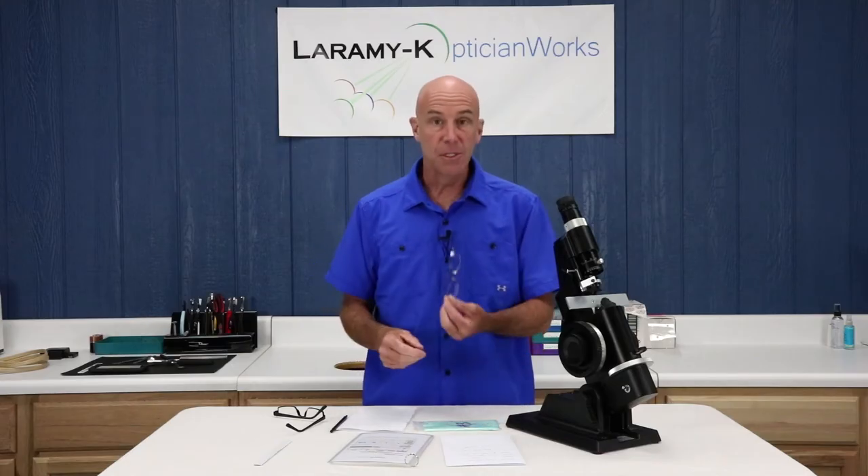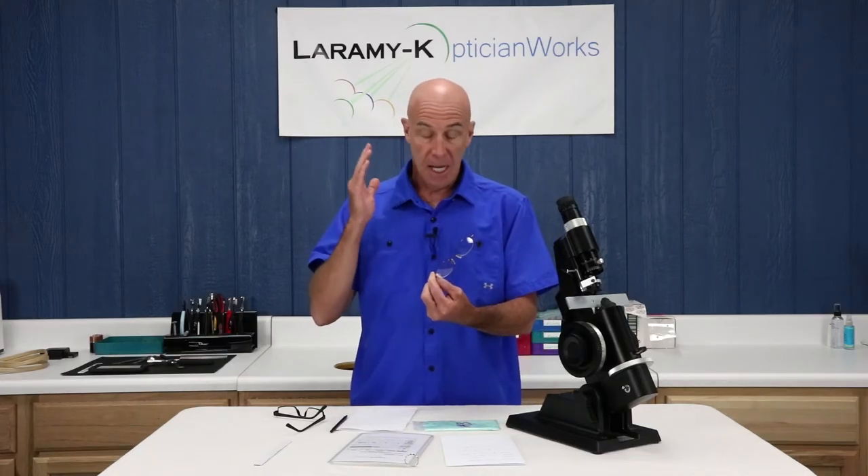I can guarantee you with 100% certainty that this is going to happen to you on a fairly regular basis as a working optician. Somebody's going to come up to you, give you a complete pair of glasses, and say, I need to know what's in here.